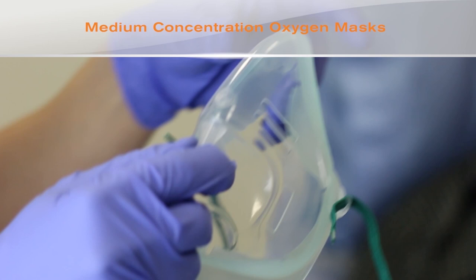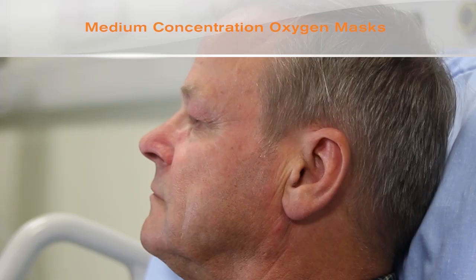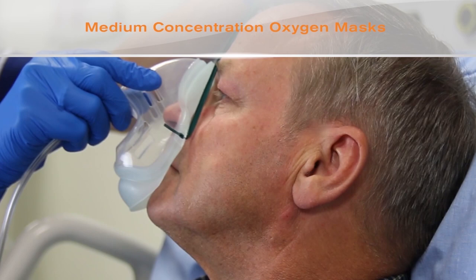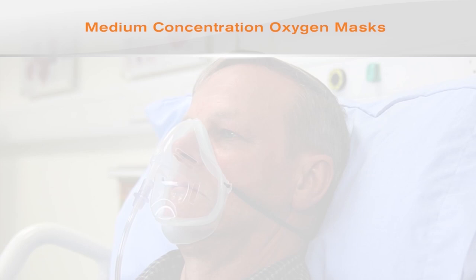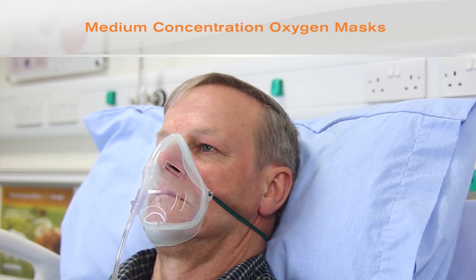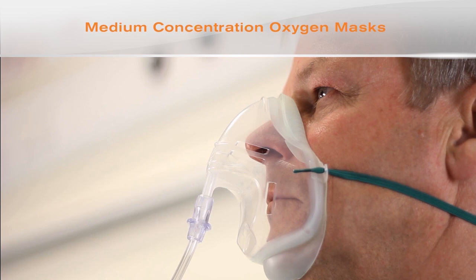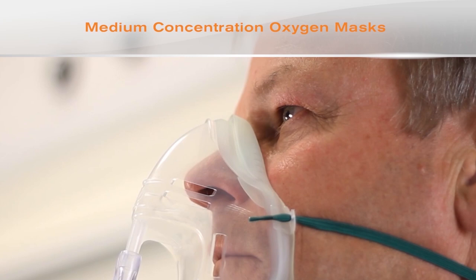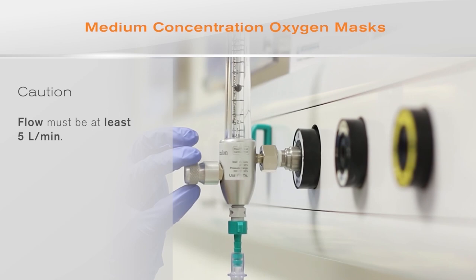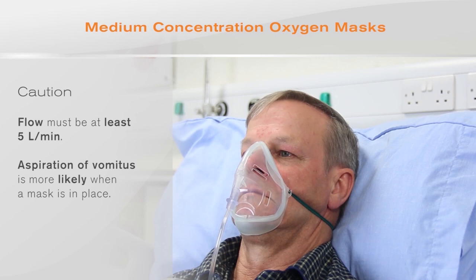One end of the oxygen tube is attached to the spigot on the mask and the other to the oxygen flow meter. The mask is then fitted over the patient's nose and mouth and the elastic tightened to give a secure and comfortable fit. New generation Intersurgical Ecolite oxygen masks can also be secured under the ears to avoid pressure sores. It is important to use a mask which obtains a good seal on the patient's nose to prevent oxygen entering the eyes, as a poorly fitting mask can result in exposure keratopathy and corneal perforation. Caution must be taken to ensure that flow is at least 5 litres per minute to wash carbon dioxide out of the mask and prevent re-breathing. Aspiration of vomitus is also more likely when a mask is in place.